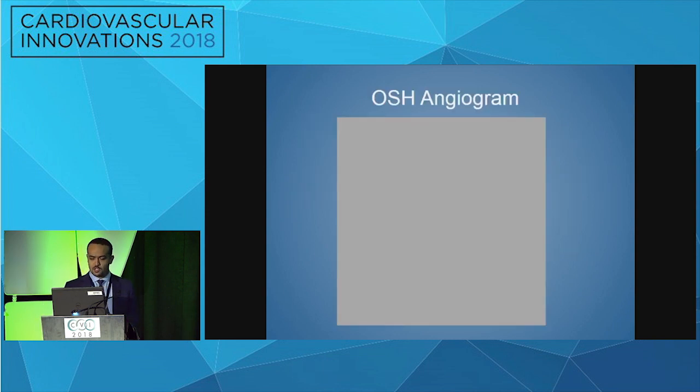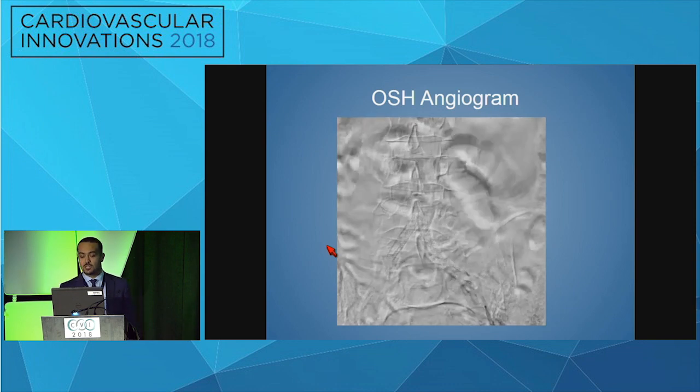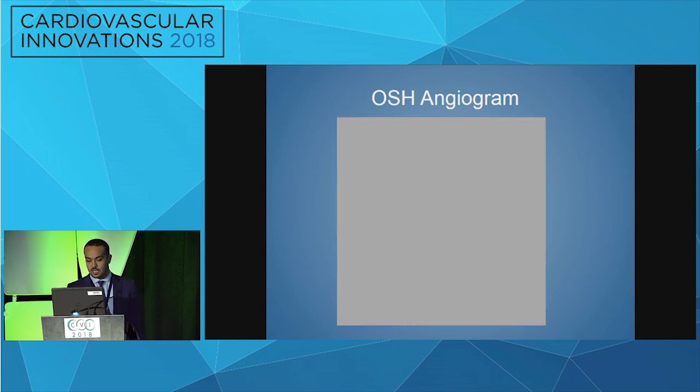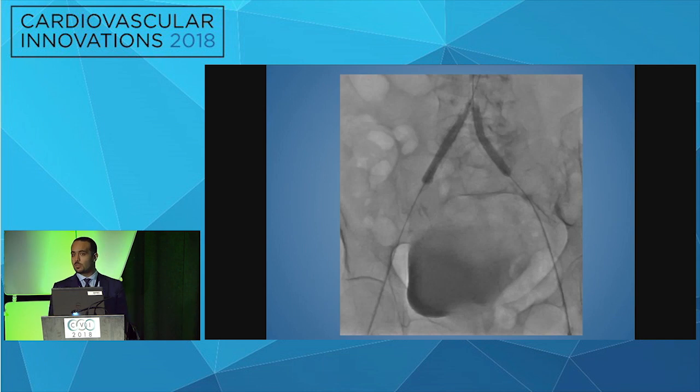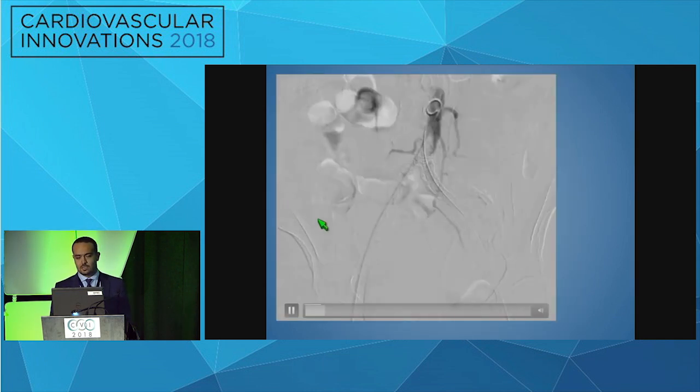So, the outside hospital angiogram right before the transfer: when she presented over there, they went left common femoral access. The first angiogram shows not much flow up in the aorta. The stents may be occluded, it's unclear what's happening in there. They did do balloon angioplasty, and these were their final results.